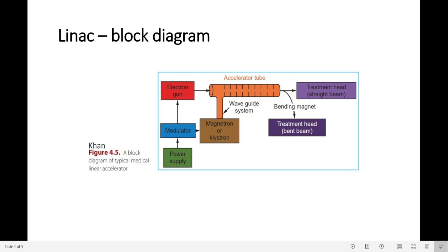Here I have a block diagram of a medical LINAC. It shows its major components. We are going to go over all of them and it's going to give you an idea how a LINAC works.